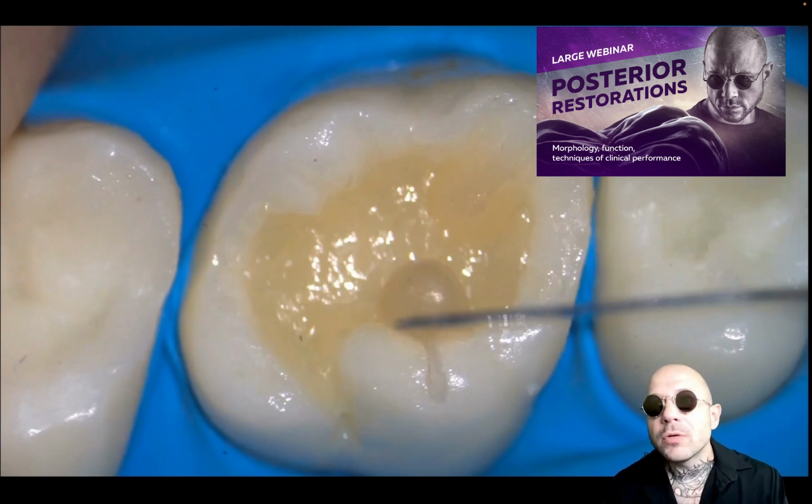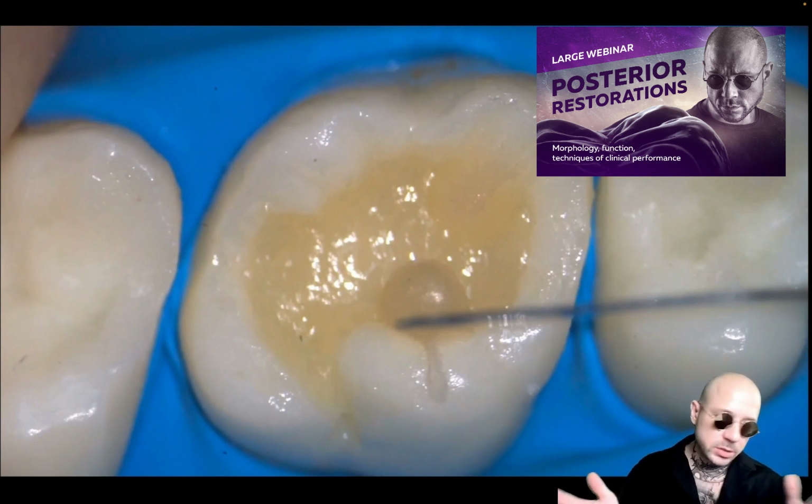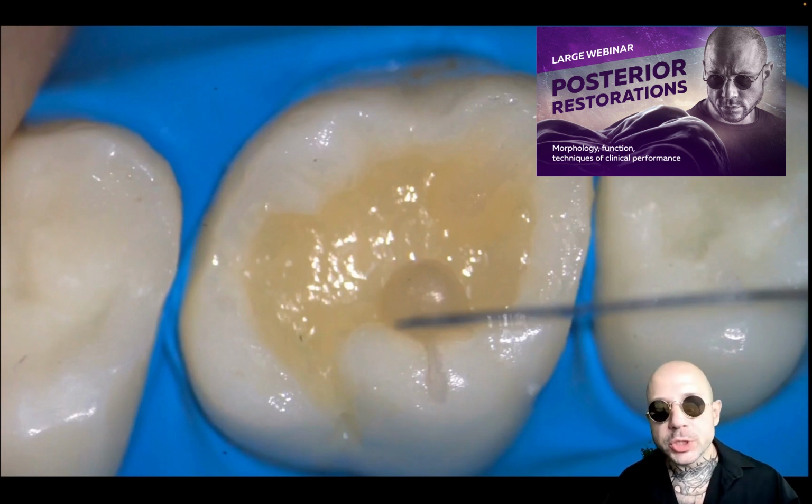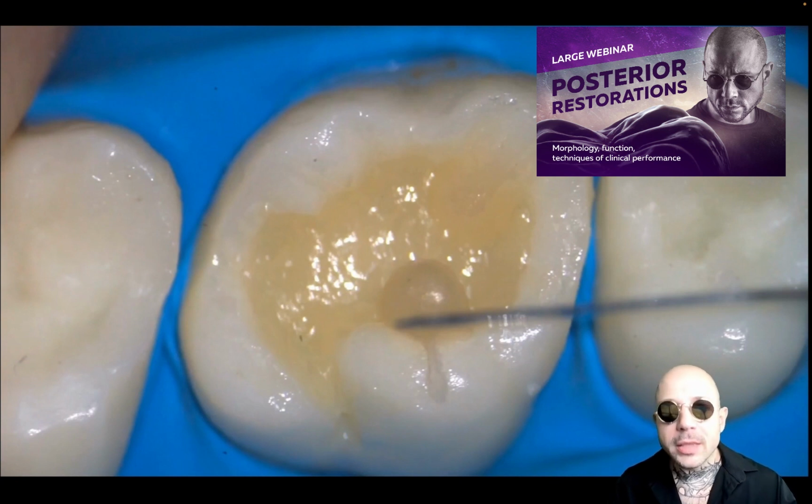I told you how to do that management of horizontal displacement, possible displacement of reproducible ridges. But what can we do with the volume, how can we verify and evaluate volume and its efficiency, or maybe excessiveness of the volume?